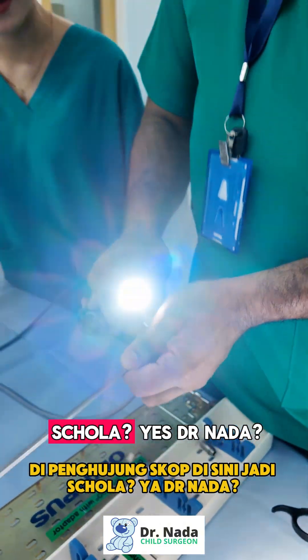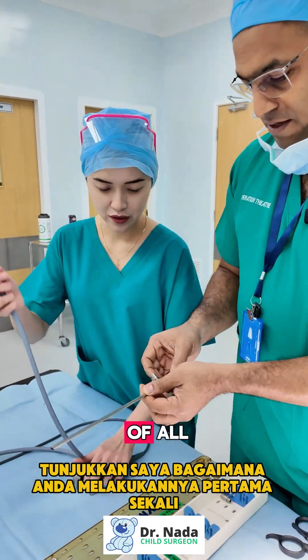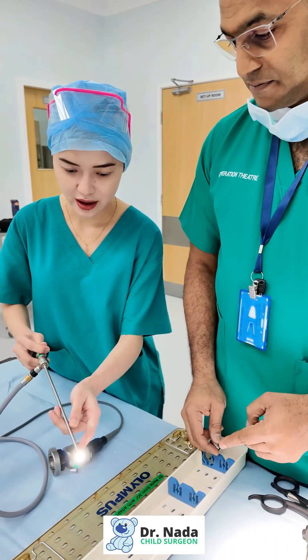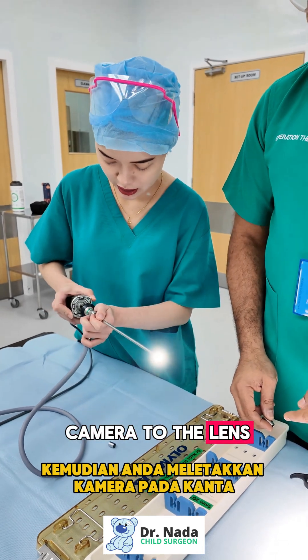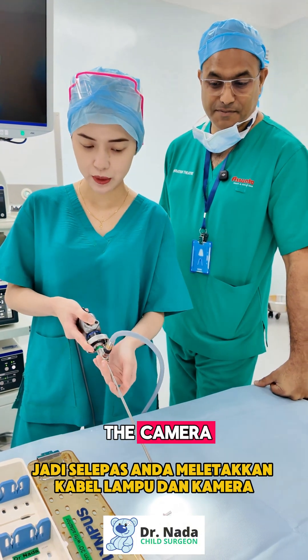So Scola, how do we assemble this? Show me how you do it. First of all, you put the light cable here — you can see the light now. Then you attach the camera to the lens, and there you go. After putting in the light cable and the camera, you can see what the camera picks up.